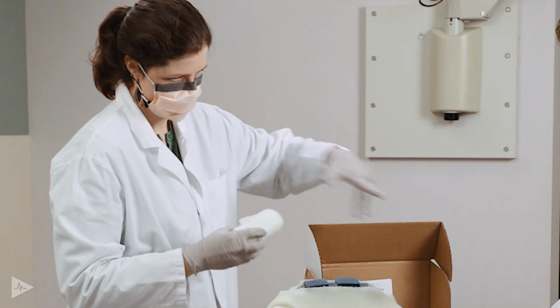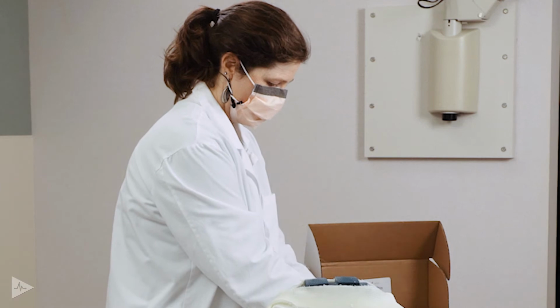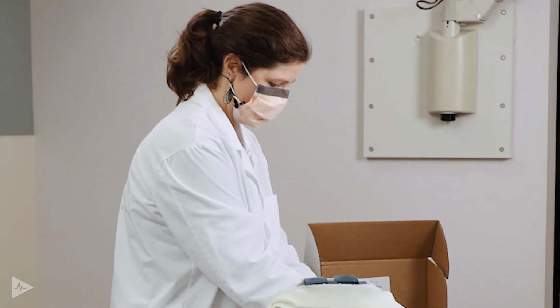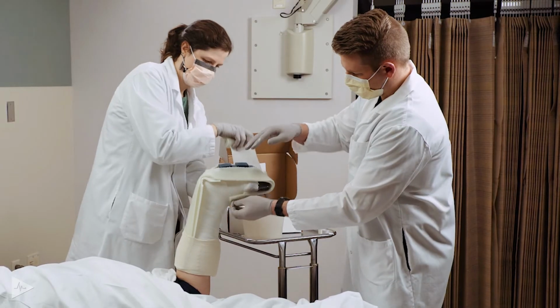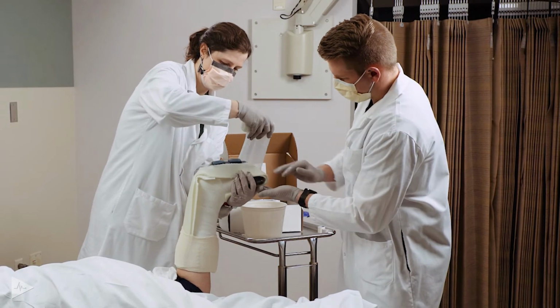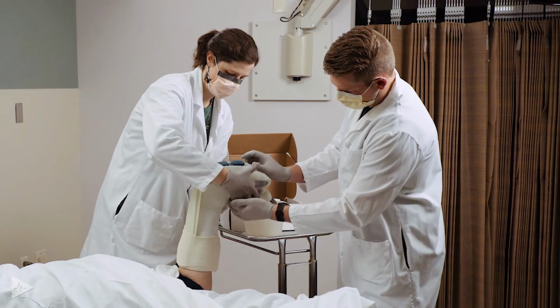Again, this will be one that we need to submerge, hanging on to the leading edge. Listen for those bubbles till you get all the air out. Bring that out, squeeze out the excess water. And again, hang on to your leading edge, and we will start securing the final piece, holding those fiberglass splints in place.